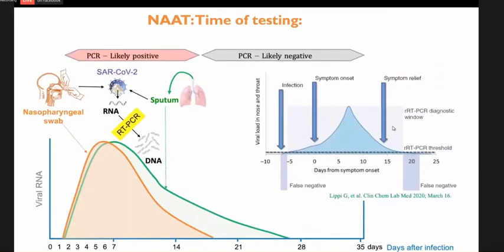So, in order to avoid various pre-analytical issues, including inadequate procedures for the collection, handling, transportation, and storage of the specimen, the selection of the appropriate timing of specimen collection is another crucial aspect to maintain the clinical sensitivity of nucleic acid testing. False negative results may be caused by the low viral load in the early and later stages of the disease. Therefore, it is very important that the sample is collected within the diagnostic testing window.